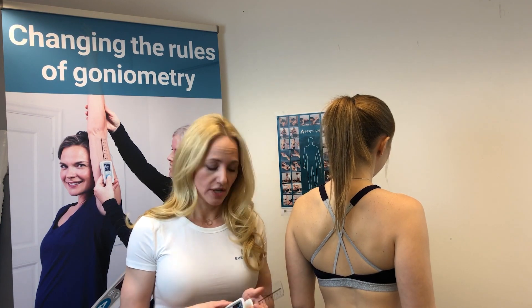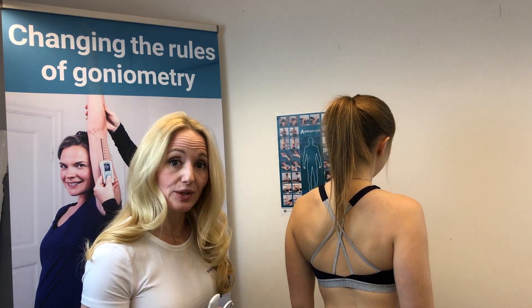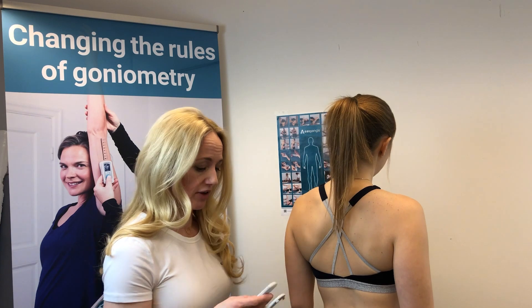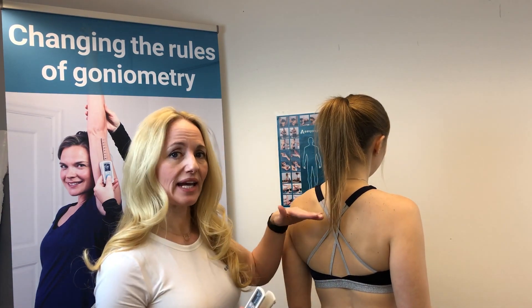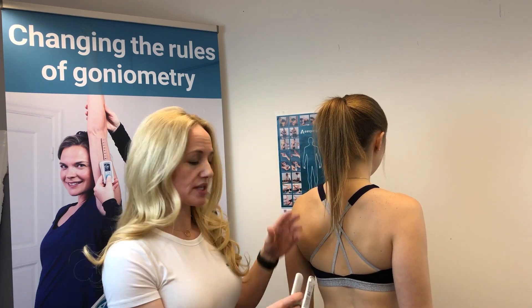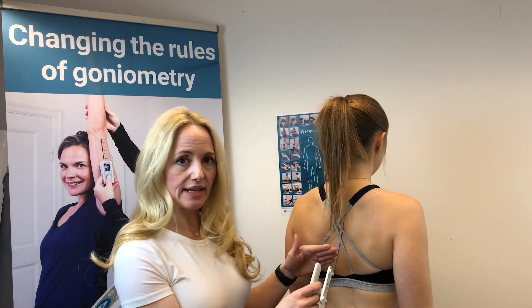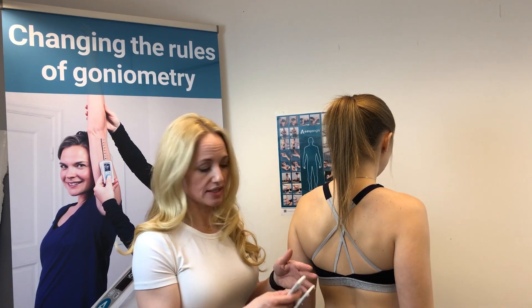We don't need the ruler, so we're going to pop the ruler off for this measurement and pop that into your pocket for later use. In order to take the measurement we need to identify the first vertebra in the scoliosis, then find the apex, and then find the last vertebra that is twisted.